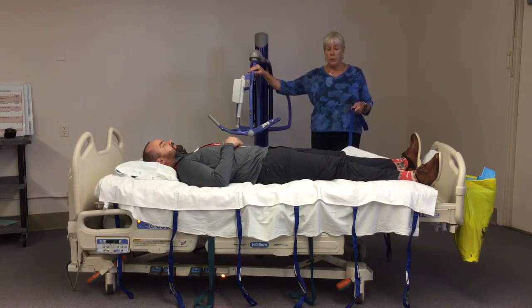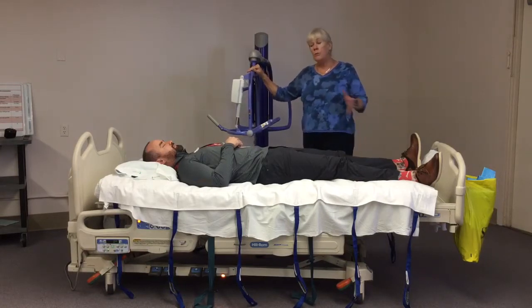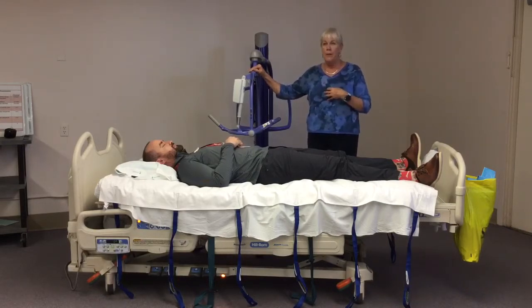We can use the Maxi Move and the repositioning sling to move a patient up and down a bed, side to side in bed, and we can also use it to roll a patient. We can use it to get our patient from bed to gurney, gurney to bed, or into another bed.